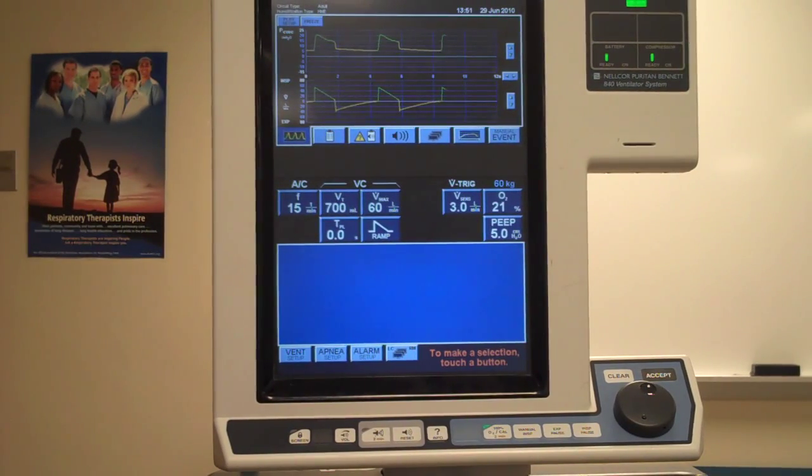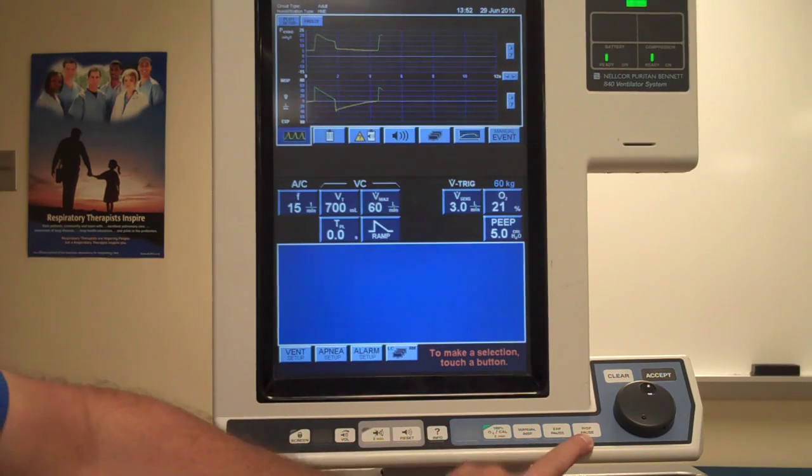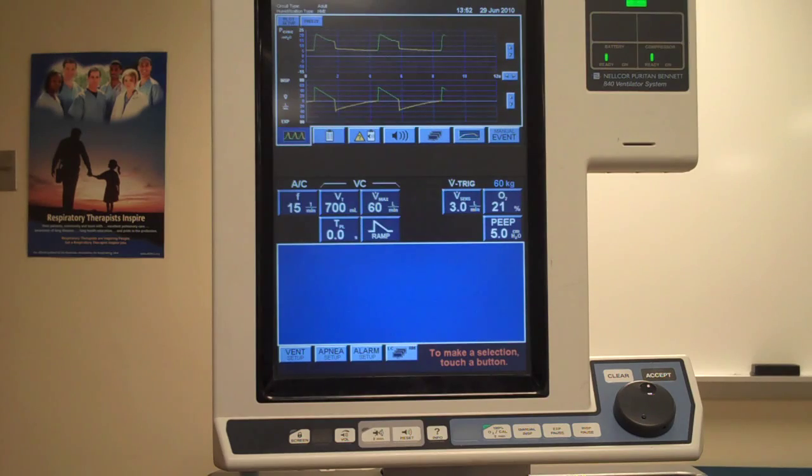Determination of static pressure, airway static compliance, airway resistance, and auto PEEP on the 840. The Puritan Bennett 840 has two buttons on its front panel — expiratory pause and inspiratory pause — and those two buttons are what we're going to utilize to do these measurements.